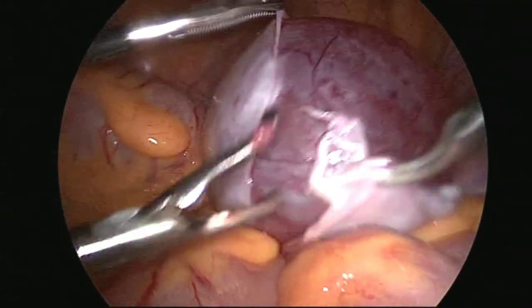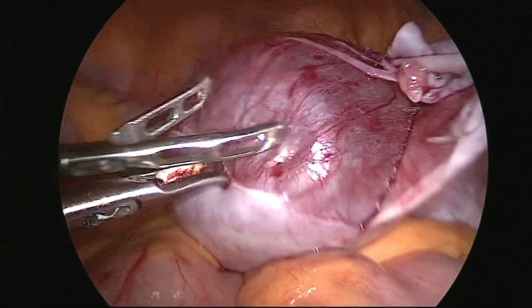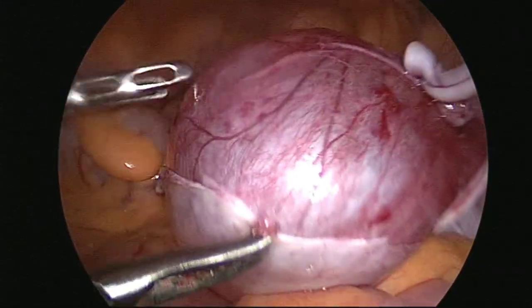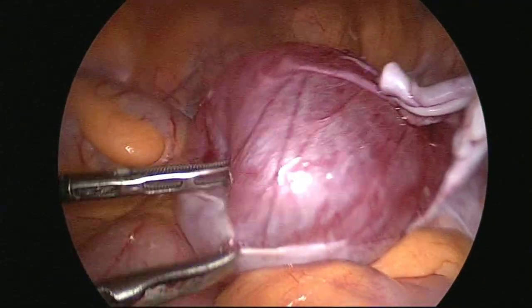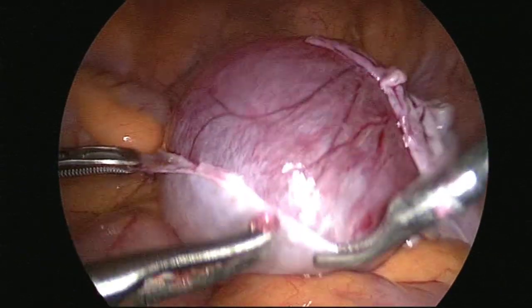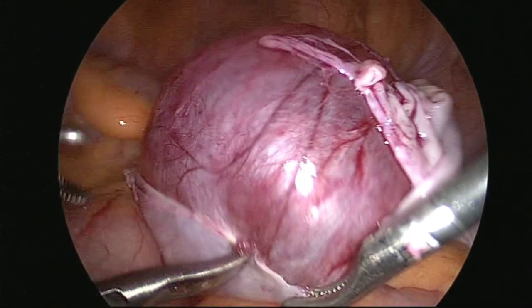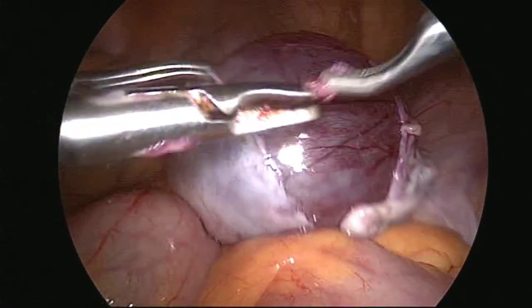Good one. Few more fibers are there. I'm using all atraumatic instruments, that's why I'm not able to hold the cyst wall.